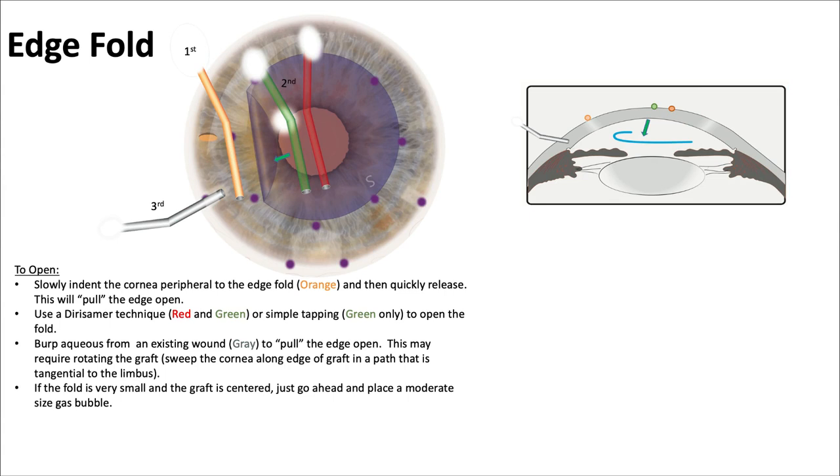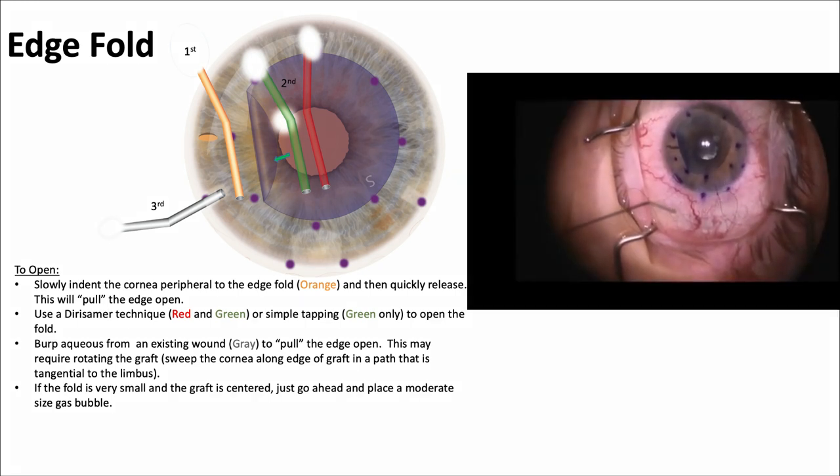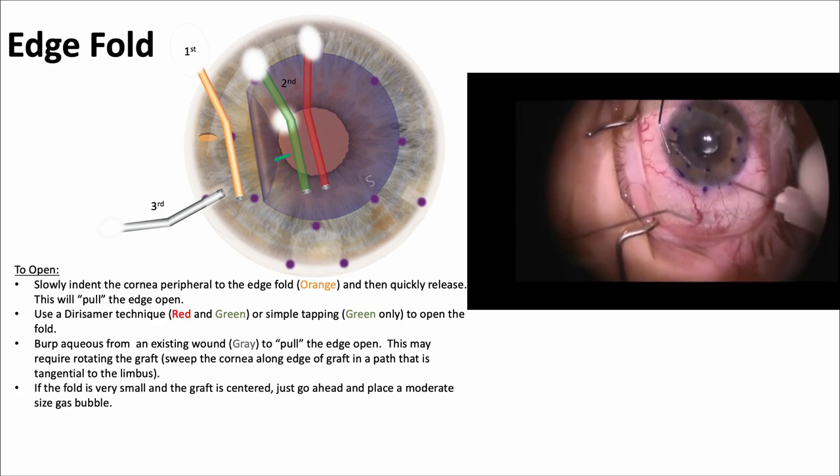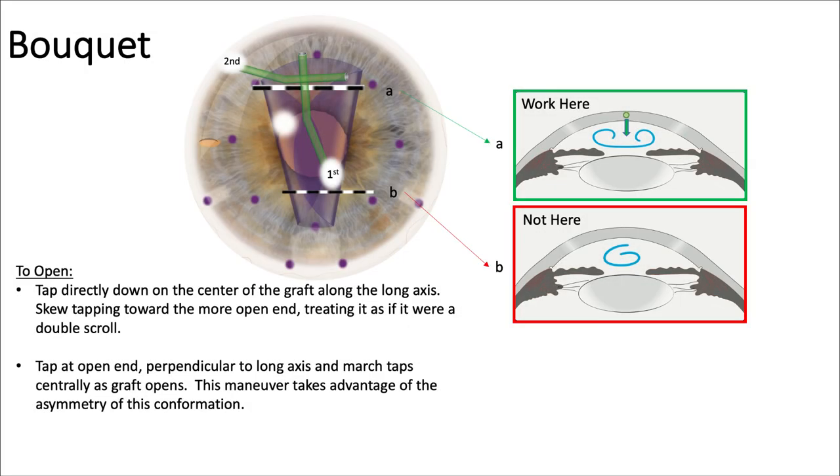For an edge fold, slowly indent the cornea peripheral to the edge — that's where the orange cannula is — then quickly release. The Derisamer technique with the red cannula and the green cannula definitely works. You can also tap with the green cannula, or burp aqueous from an existing wound using a third gray cannula to allow fluid to exit. If the fold is very small and the graft is centered, just place a moderate gas bubble and that may open it up. Many different techniques can be used — pushing fluid along the fold to get it to open up.